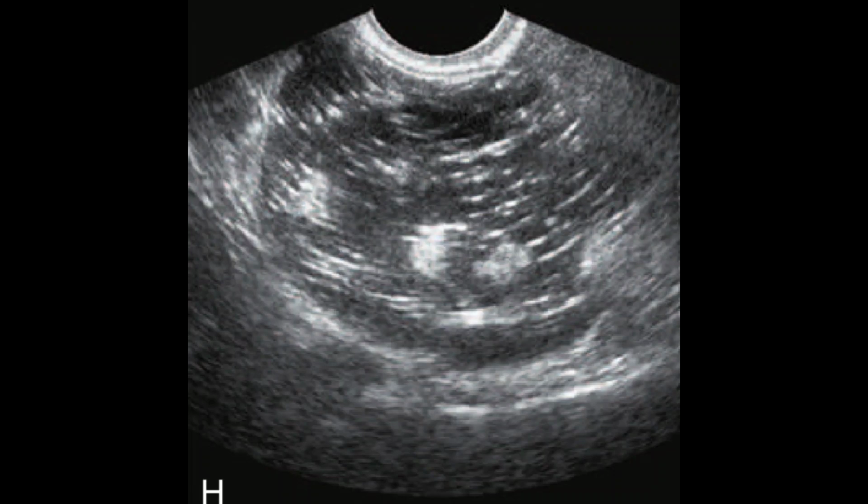All these characteristics are floating within the cystic lesion. So this is a dermoid mesh. It may appear in this way, but if you are not focusing, it looks like shadowing from the intestinal contents. This may represent contents within the bowel loop, fecal contents in the bowel loop. So it's quite a confusing pattern.